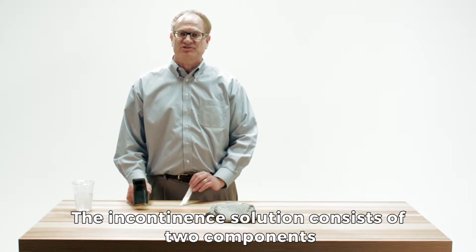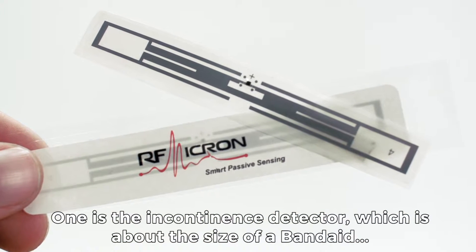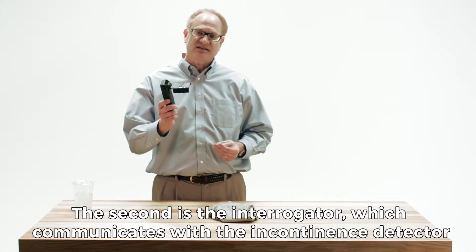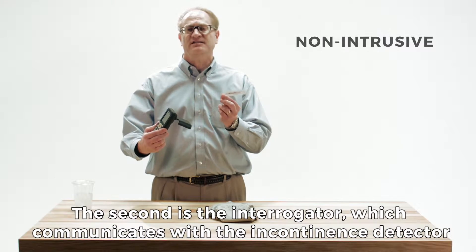The incontinence solution consists of two components. One is the incontinence detector, which is about the size of a band-aid. The second is the interrogator, which communicates with the incontinence detector.